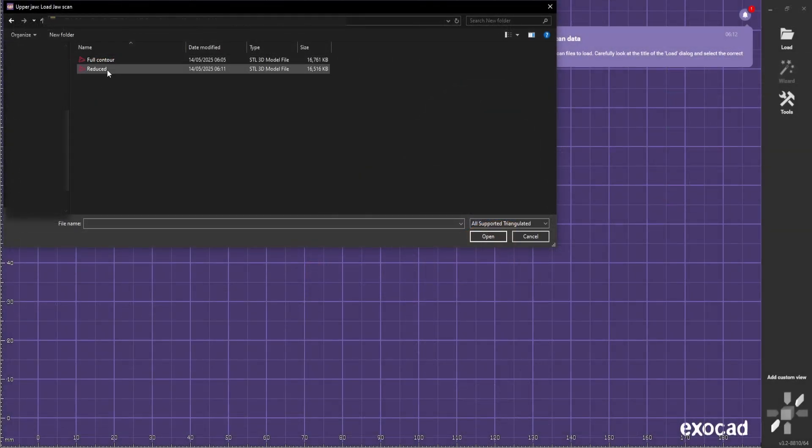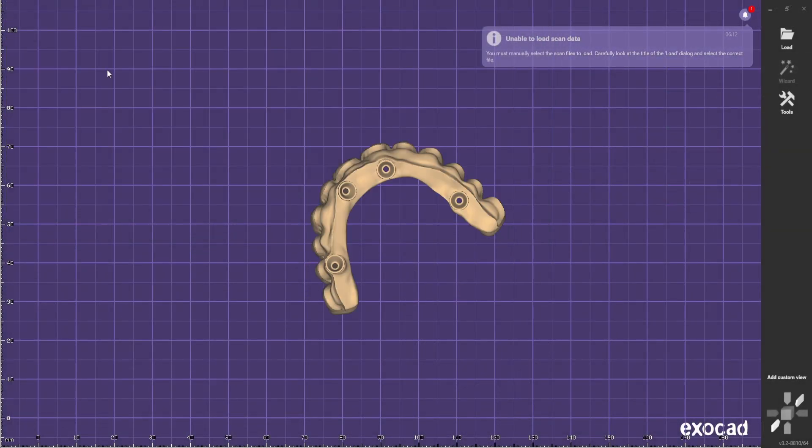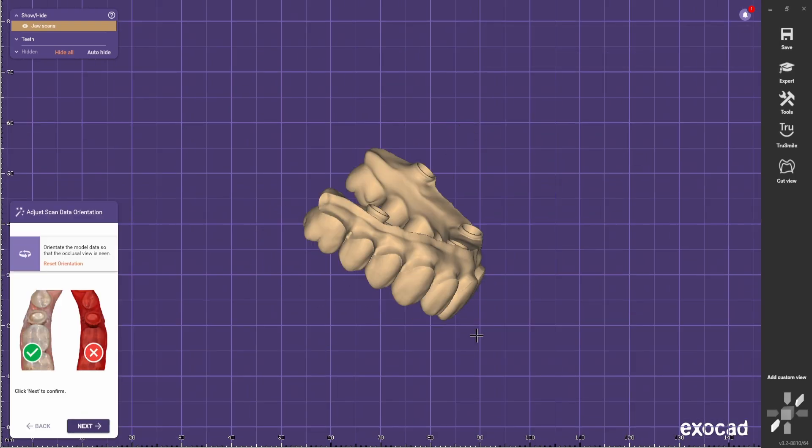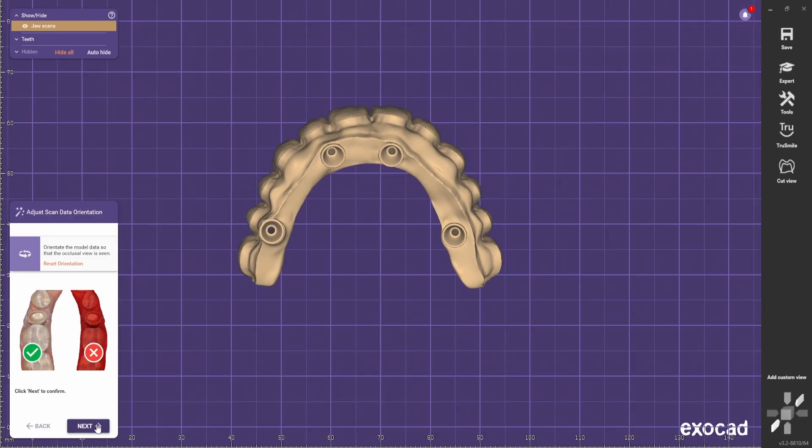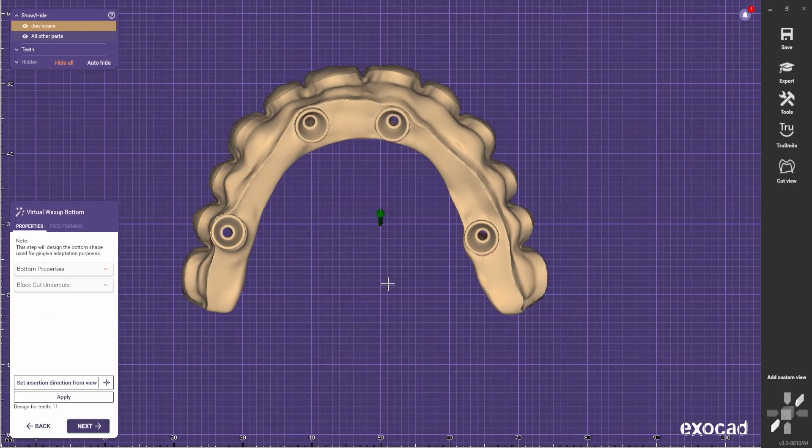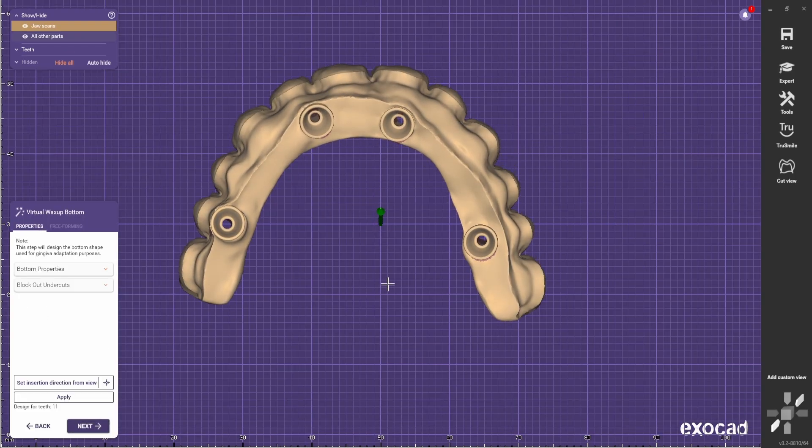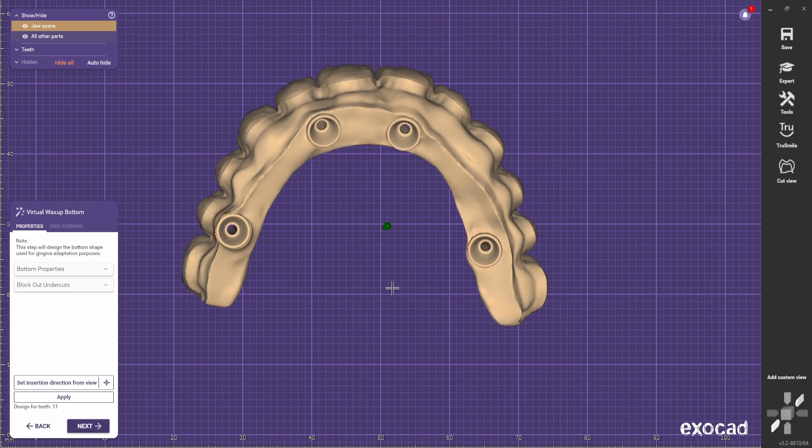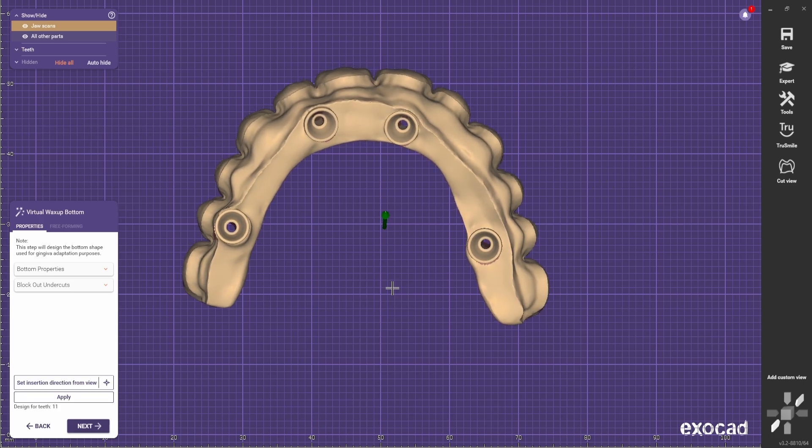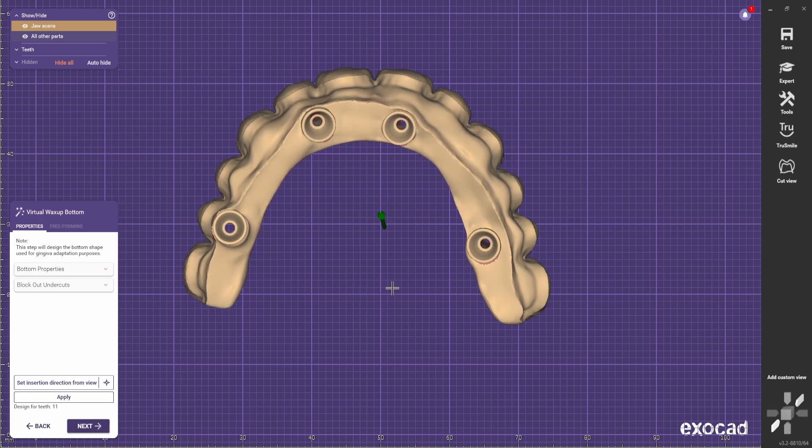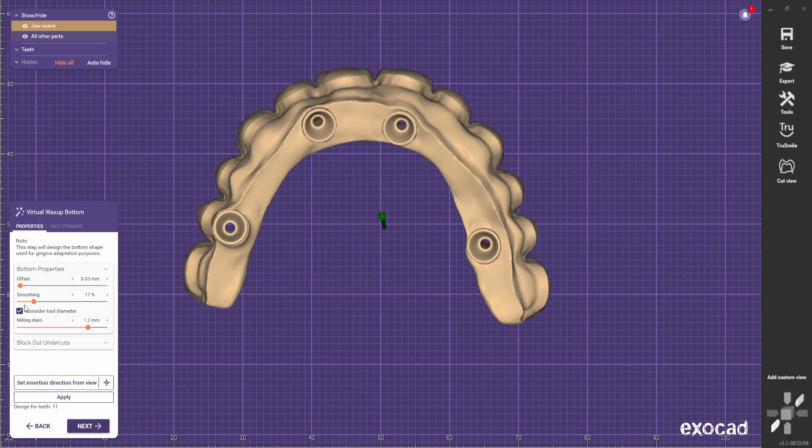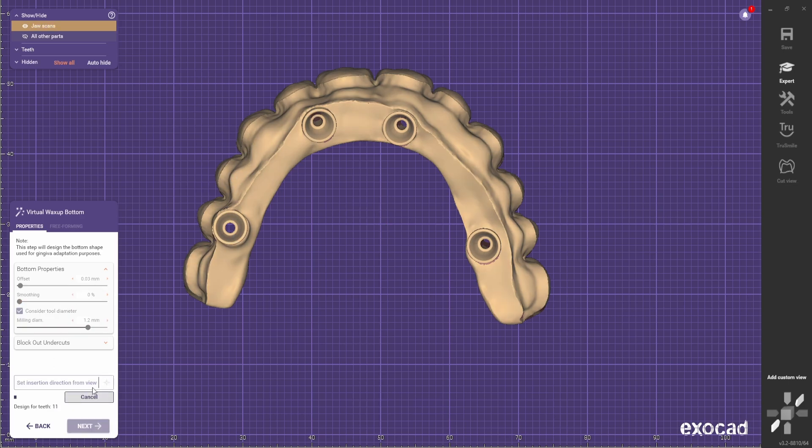We bring up the reduced one. And now we need to choose the path of insertion of the gingiva part. So basically make sure you don't do too many undercuts. And at this stage it's important to reduce the smoothing percentage to zero so it has a better fit. And click apply.